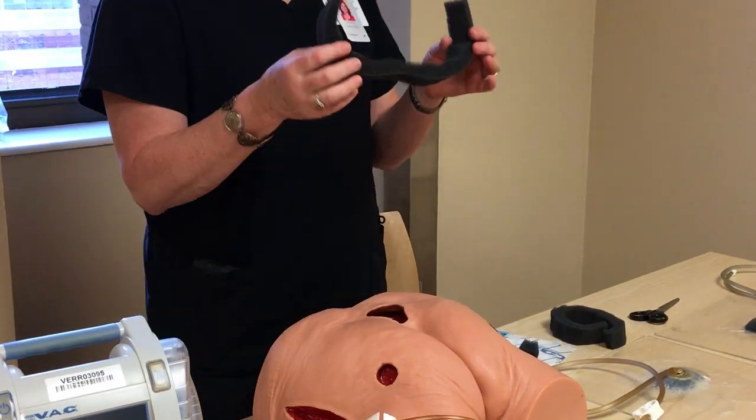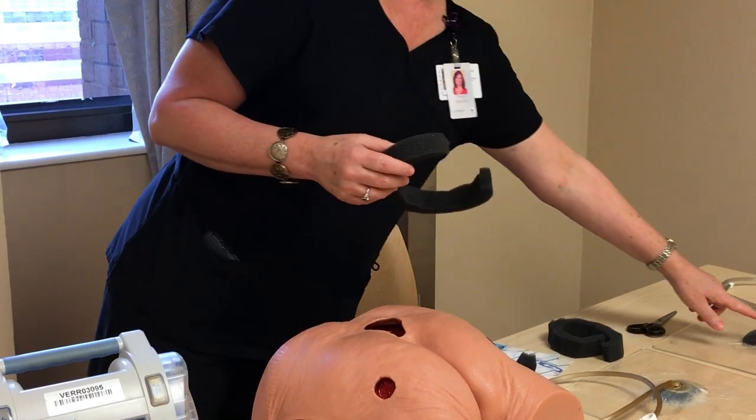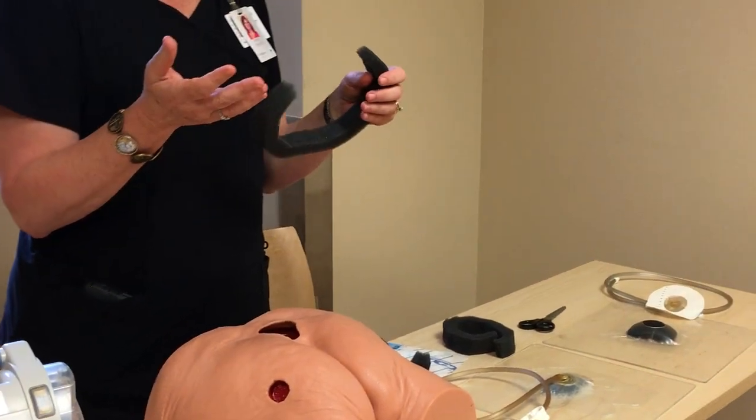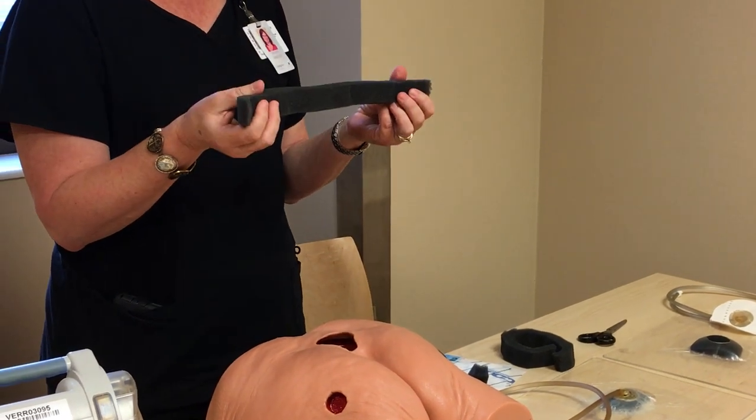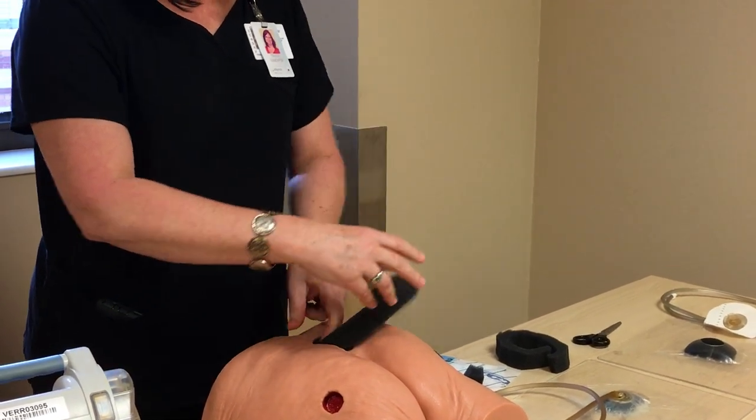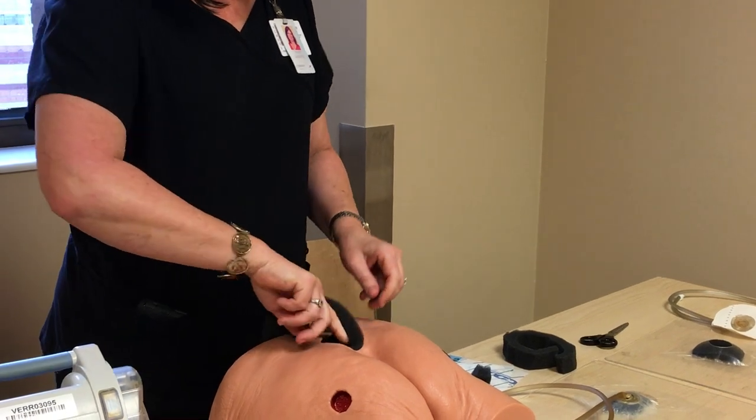Once that's down, you can take your foam and you can either cut it like this, or you can cut it into a solid piece. It really depends on the shape or size of your wound, but I prefer this technique because I can do it really quickly. I'll fill the wound bed in with the foam.